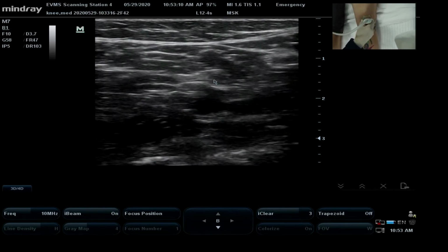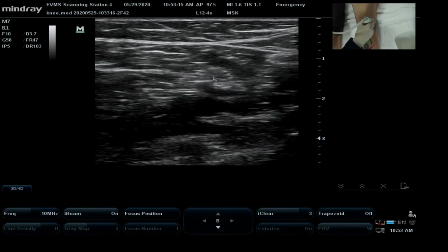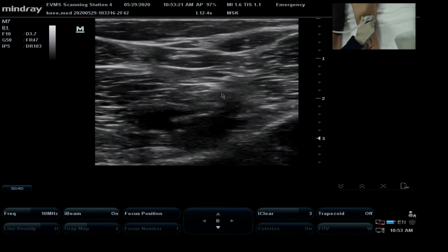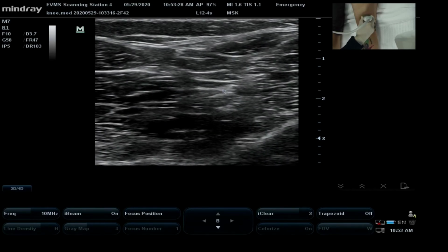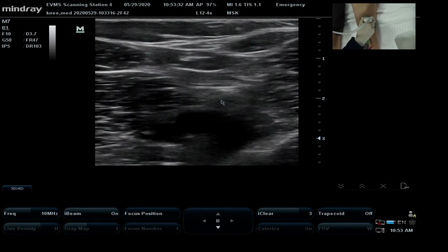And so if you were going to put any sort of anesthesia, and you were directing it towards the tibial nerve, it would be here. Typically though, you would go more superior, to when it becomes the sciatic, or when it is the sciatic, which you know is made up of the tibial and fibular nerve. This is the more obvious place that you would put anesthesia.